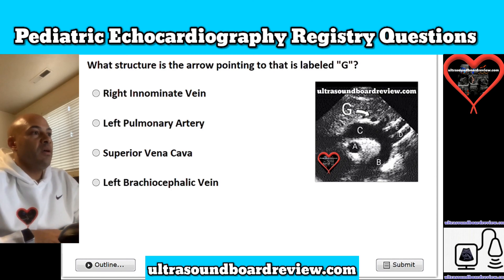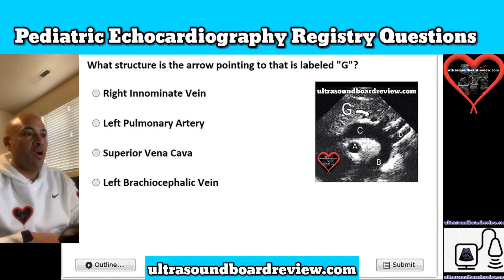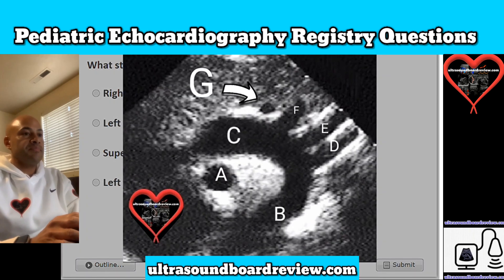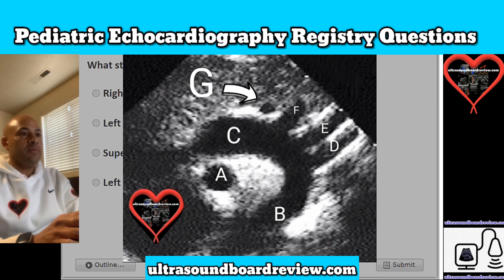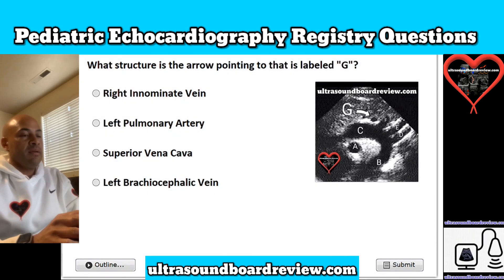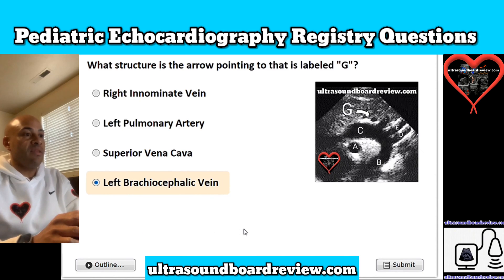Question 17. What structure is the arrow pointing to that is labeled G? Is it A, right innominate vein; B, left pulmonary artery; C, superior vena cava; or D, left brachiocephalic vein? The answer is D, left brachiocephalic vein, also known as the left innominate vein.